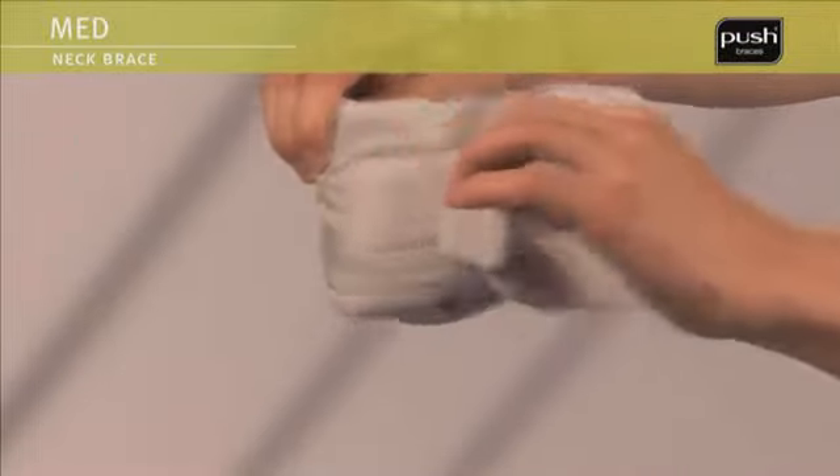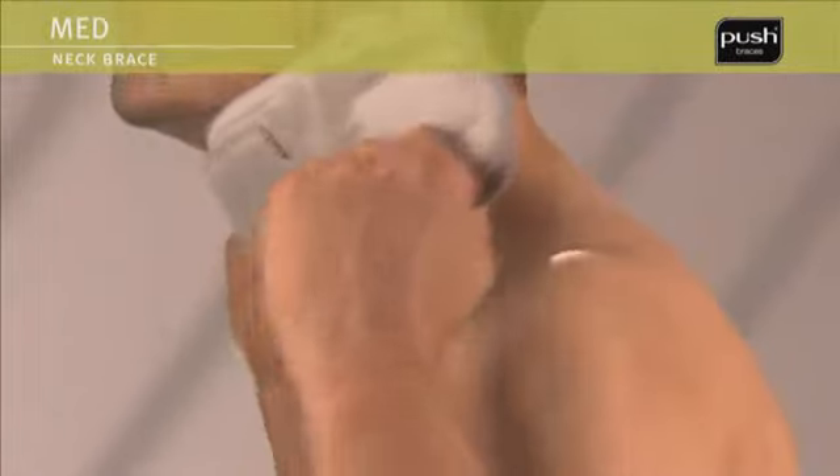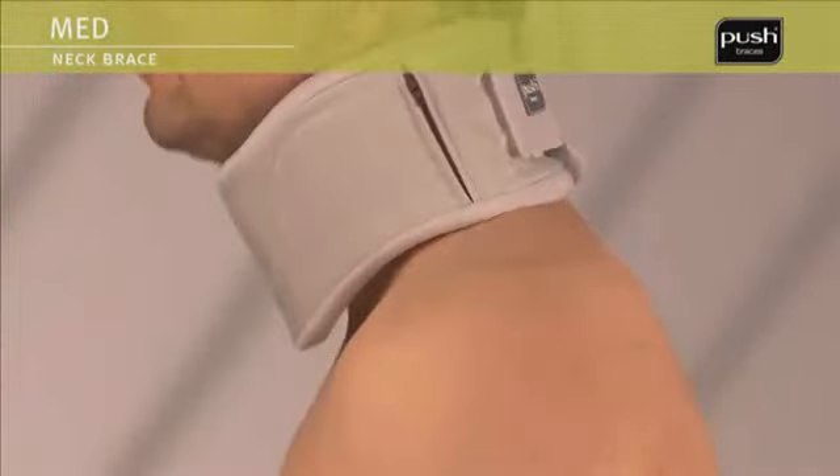Hold the brace in both hands in front of you so that the inside is visible. The point at the center of the brace should be pointing down. Then close the Velcro at the back of the neck.